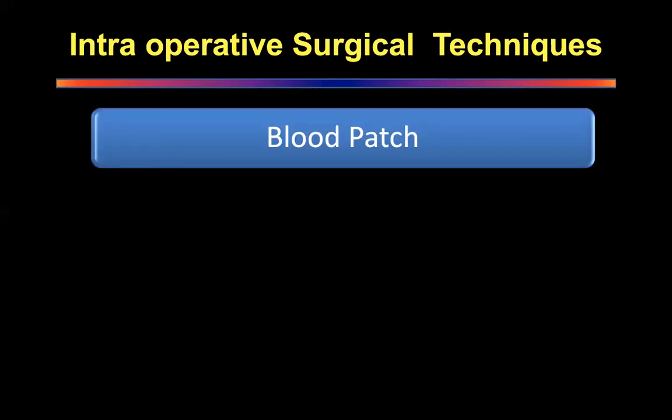On table, you have options of putting in a blood patch onto an area. If you think your stitches are not going to stick well, you just take the patient's own blood, put it there, and put a Surgicel on it, and that forms a patch on the surface of the lung.